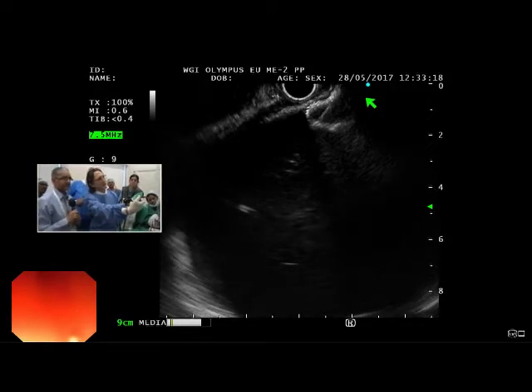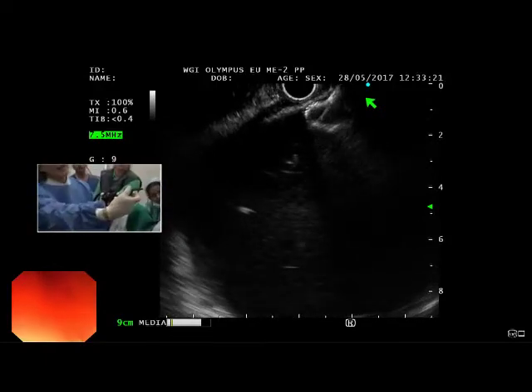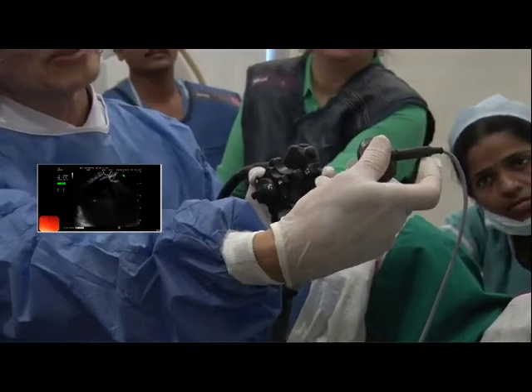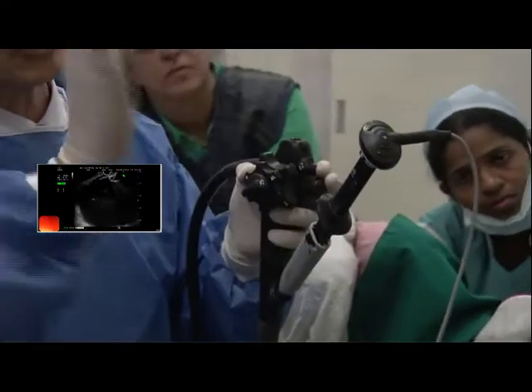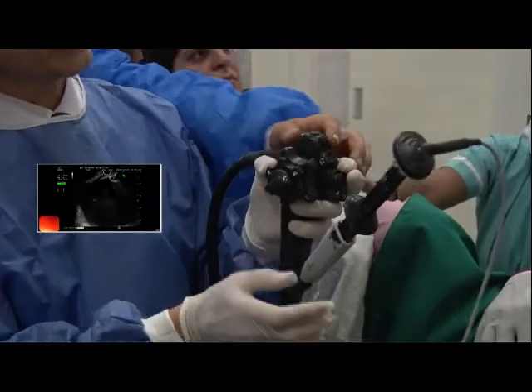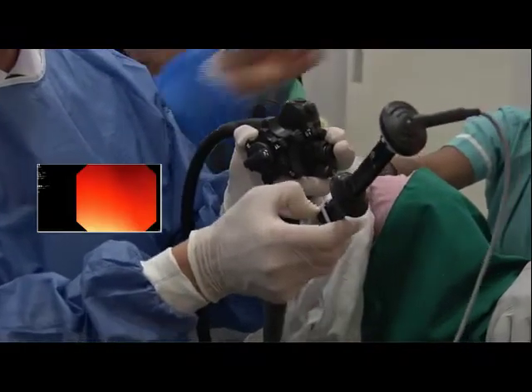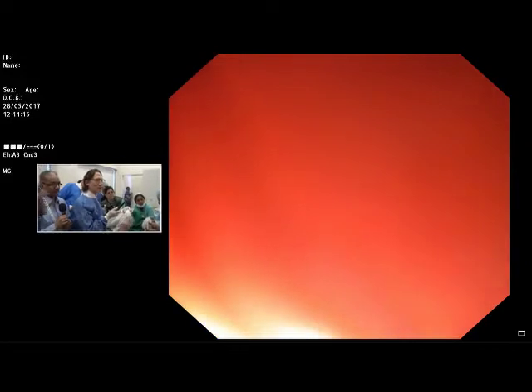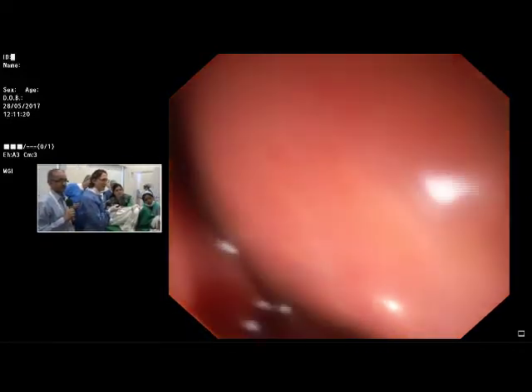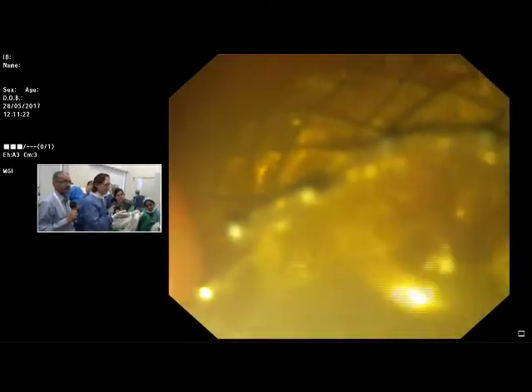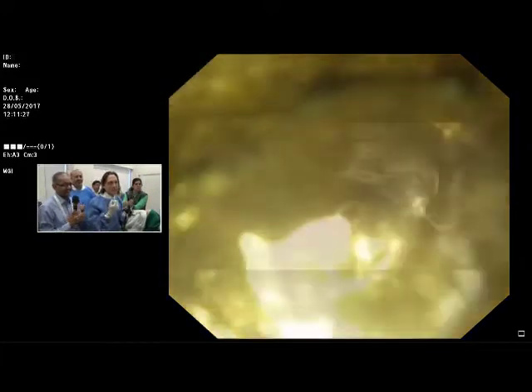As I'm pulling back, it's deploying the proximal flange in the working channel. Now I'm ready to switch to the endoscopic view — full screen. I'll unlock the hub and start to give some air, and as I give the air, I'm going to pull away and start pushing out the stent — and there it is, deployed. The fluid is gushing out, it's decompressed, flowing vigorously.